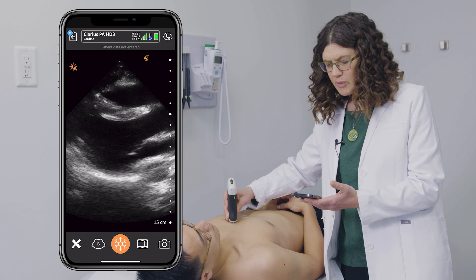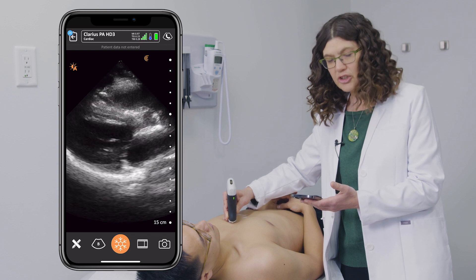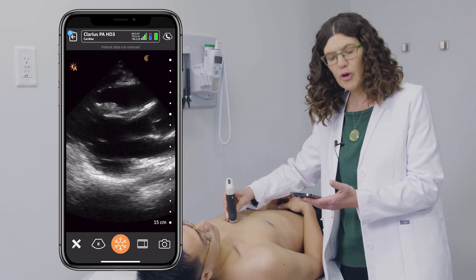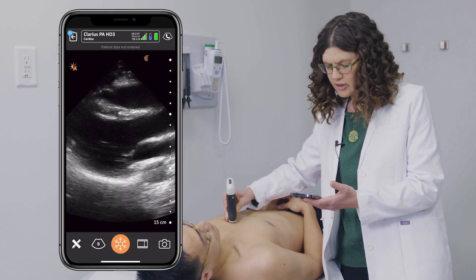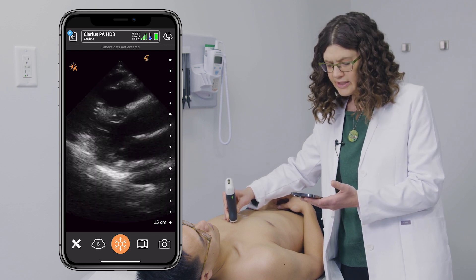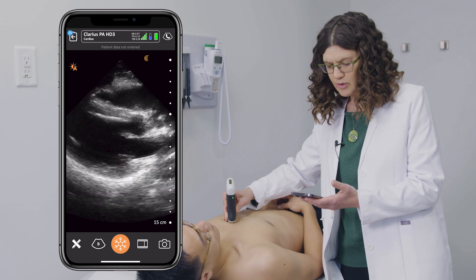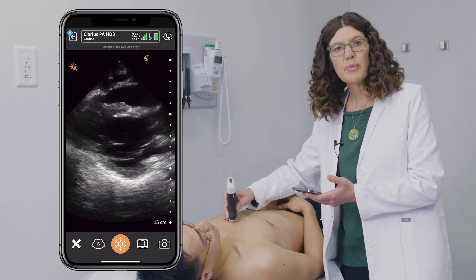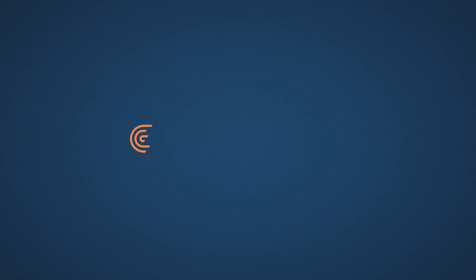This view gives me a lot of information and I tend to use it with all my cardiac patients as well as anyone who has chest pain. This concludes the parasternal long view of the heart.